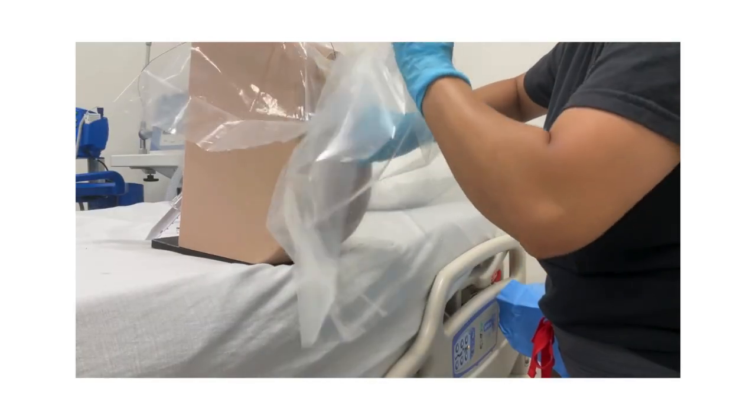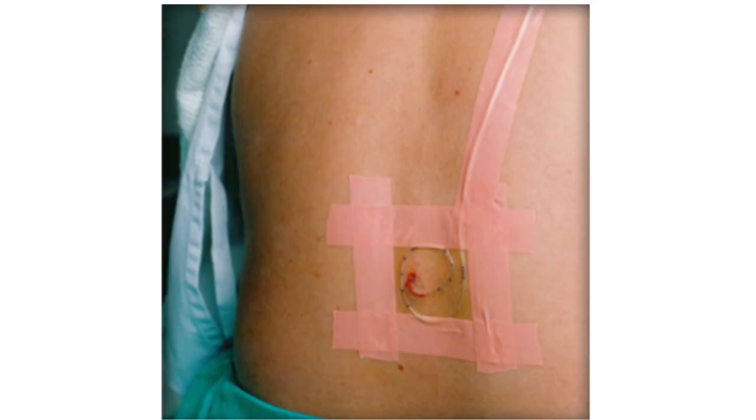Remove the drape and finish the dressing. The final dressing should be secured with tape at all four corners of the transparent dressing, plus one long strip of tape running along the length of the epidural catheter over the patient's shoulder on the side of the nearest IV pole. Now that we have covered how to place an epidural, let's review how to remove it.